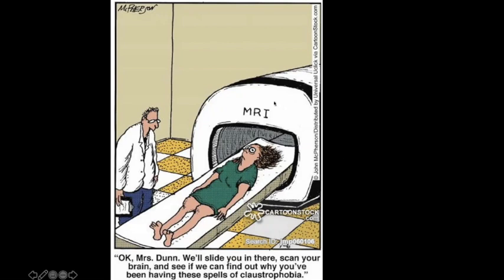Trizana has a question. Could registration to an average template be removing variability when making volumetric or surface area measurements? So for volumetric, well, you wouldn't do your estimates at the level of the average template, right? So let's say, in the coarsest example, you use nonlinear registration to map between an average template that has a manual segmentation of a brain on it, and you back propagate that to the individual in question that you want to study, right?